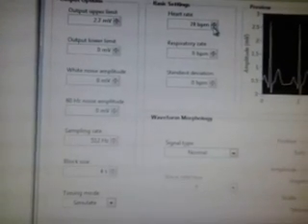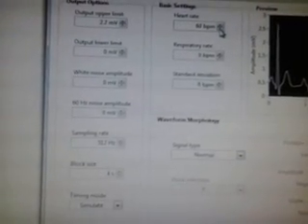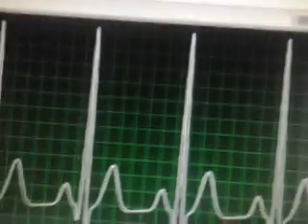See, the simulated value is converted. First we'll off the simulator, then check for 66 BPM. Now run the server.